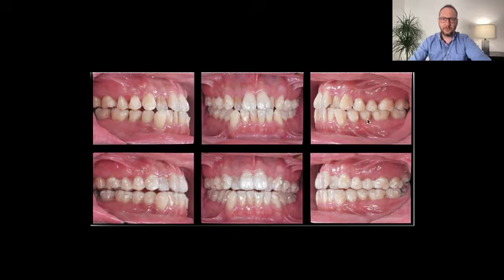And after bonding the attachment is the moment to insert the aligner number 2, okay?